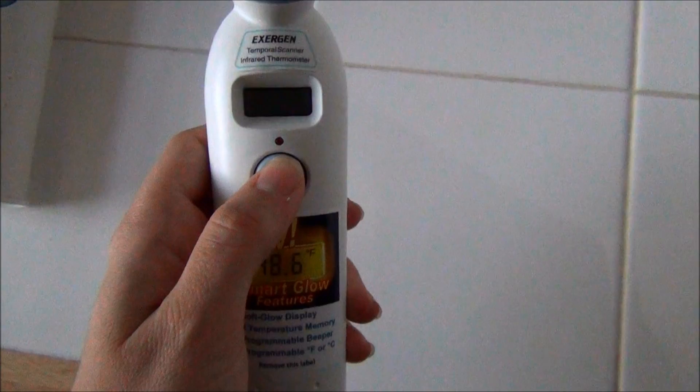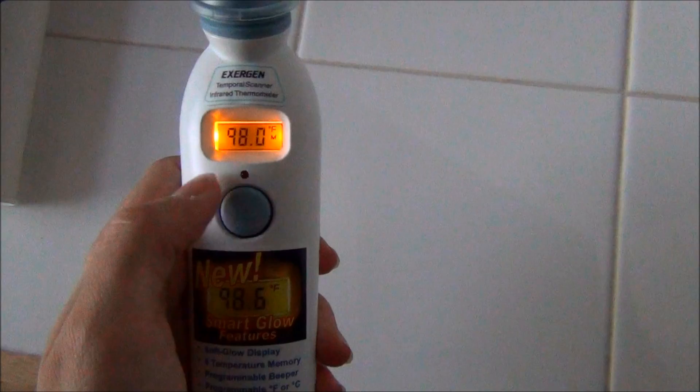My favorite thing obviously is this SmartGlow feature because right now you can't see anything. If you want to take the temperature — look at that backlight! I just took baby's temperature, so that's hers, and it has like I said eight memory.